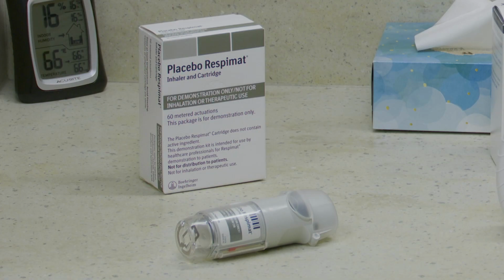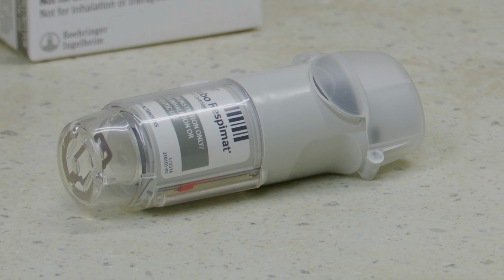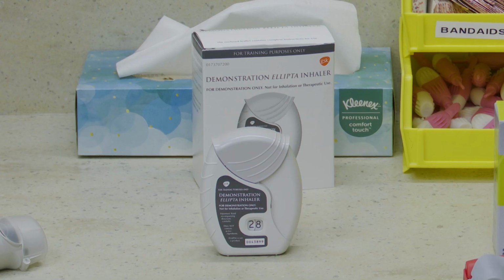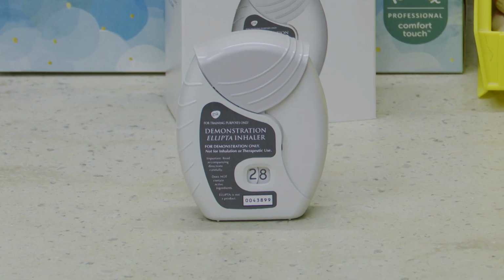The last big mistake Van Klompenburg sees is mistaking one type of inhaler with another. An example she uses is that not every inhaler needs to be shaken before using, like a dry powder inhaler. There are certain inhalers that we cannot shake, otherwise you dump the medication out of the inhaler, so then you're not actually taking any medication into the lungs.